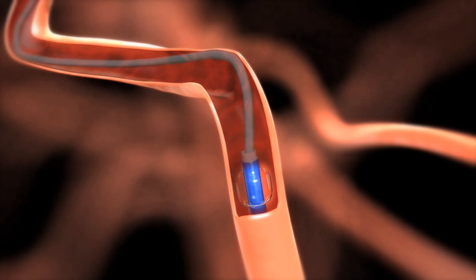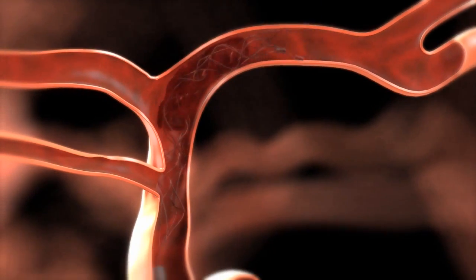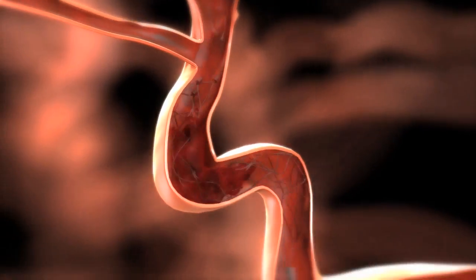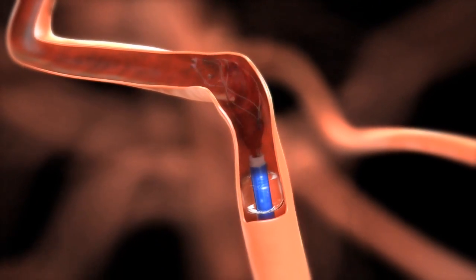Inflate the balloon of the guide catheter to occlude the vessel. To retrieve the thrombus, slowly withdraw the micro catheter and Solitaire FR as a unit to the guide catheter tip while applying aspiration to the guide catheter.